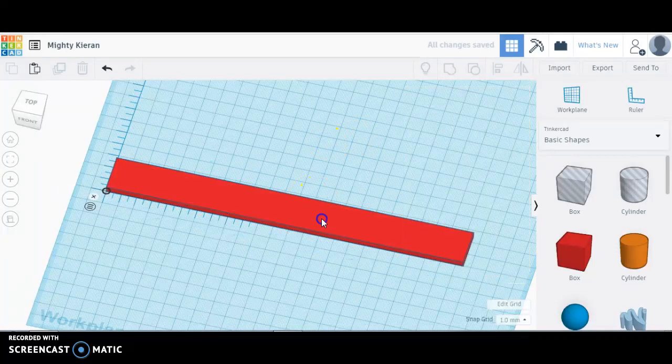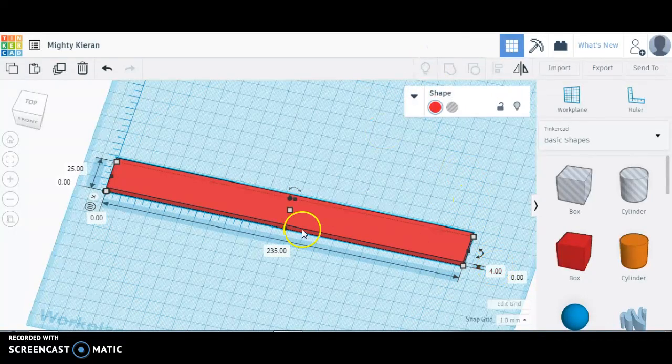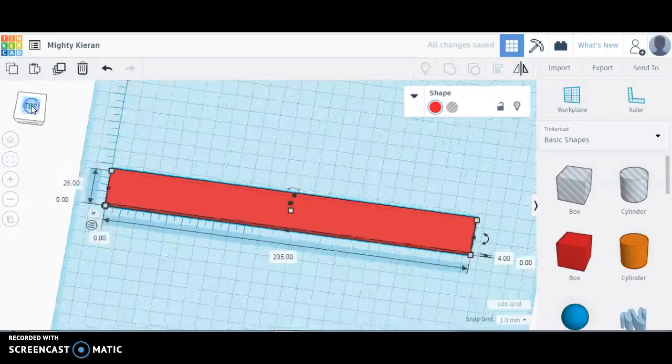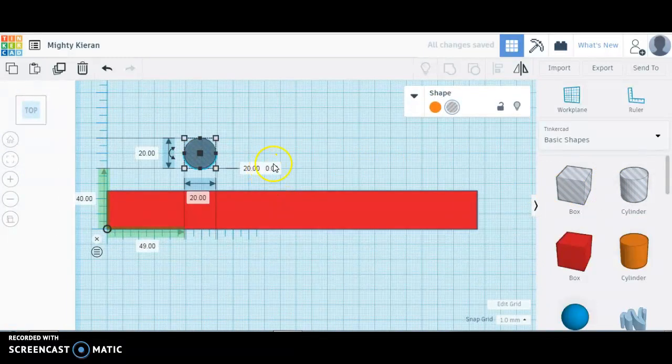or I can also set the height by adjusting here and snapping to 4 or typing 4 for the height. Okay, back to a pure top view. I'm ready to start placing some cylinders or some holes.